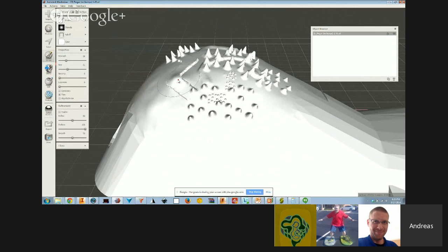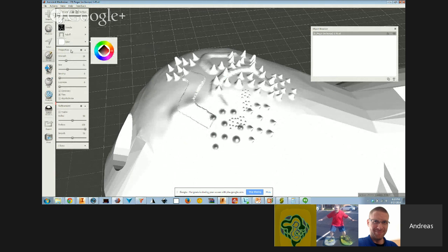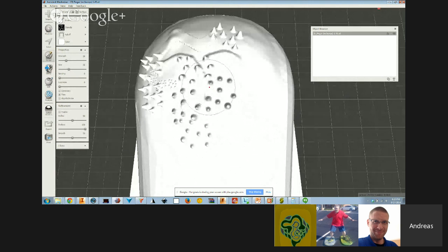Right. So here I'm doing something different. Yeah, in this case, you might have a black and white image of an actual fingerprint, and then just make the brush as big as that. Let's just do a bigger size, and then you can just kind of get a view similar to this, make the size larger. I think a quicker way to do the size, rather than having to come over here, because you want to see it previewed against the model. If you're in the Meshmixer navigation mode, it's easier, but I think it's Control right click. No, Shift right click.